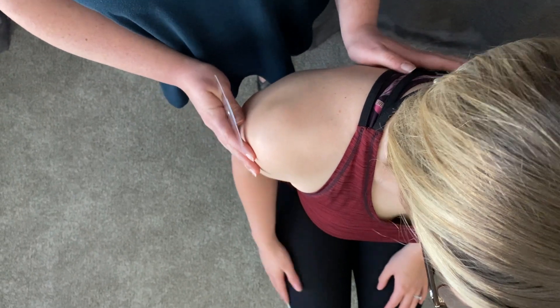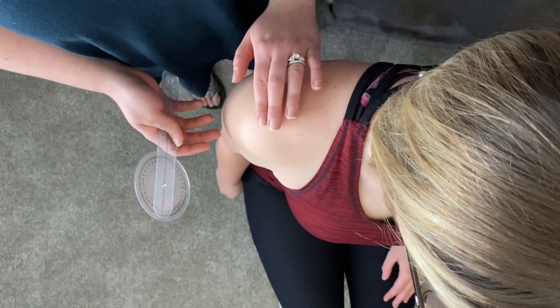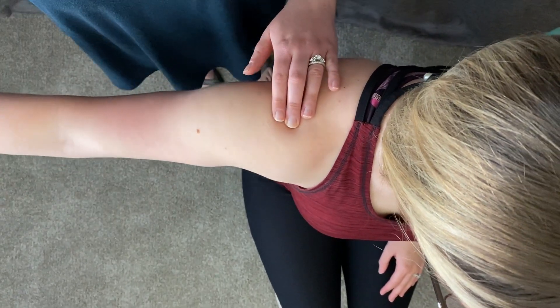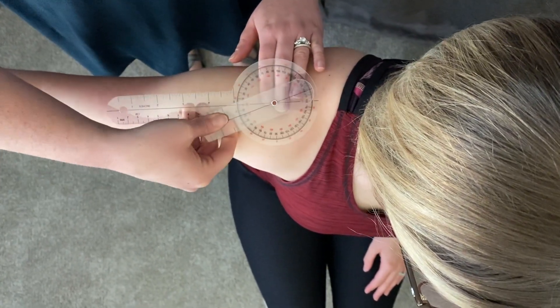You're going to start with the patient seated, sitting up straight and tall in a chair. You're going to palpate for the superior acromion process, and that is going to be the axis placement for your goniometer.